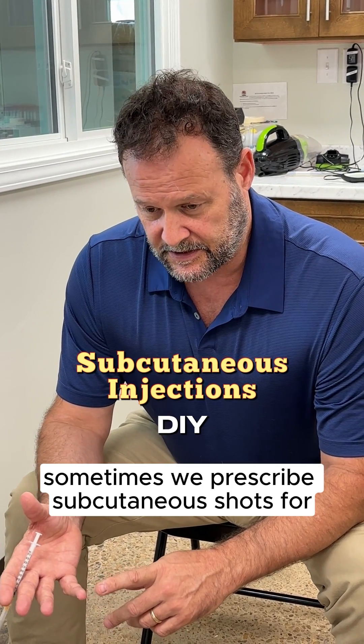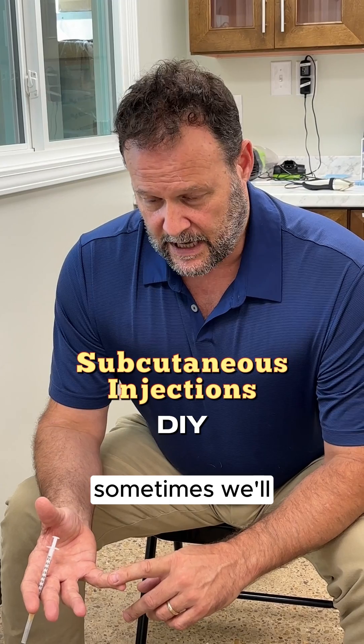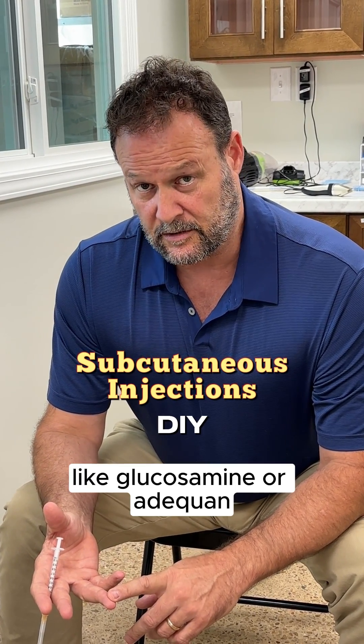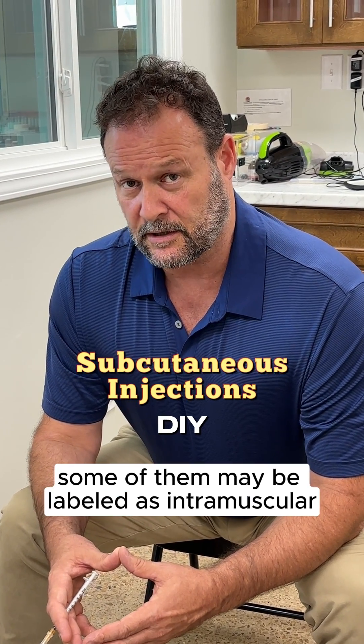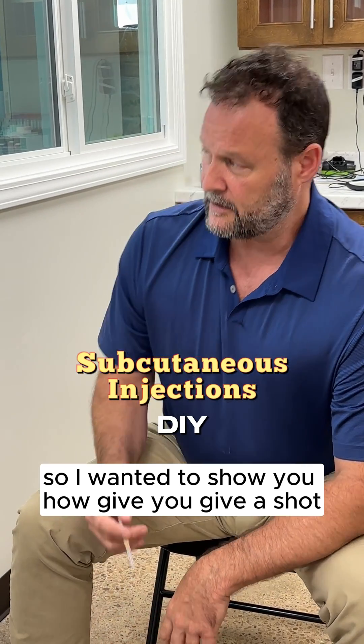Sometimes we prescribe subcutaneous shots for gastrointestinal disease, like vitamin B. Sometimes we'll prescribe shots for arthritis, like glucosamine or Adequan. Some of them may be labeled as intramuscular, but lots of times we'll use them subcutaneously. So I wanted to show you how you give a shot.